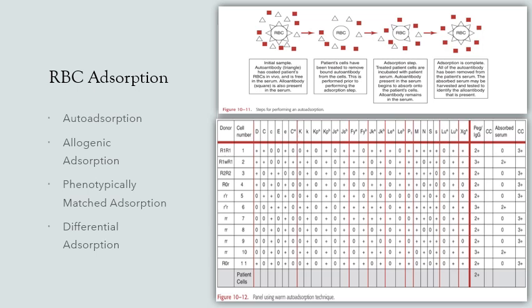So there is another example in resolving antibody identification. It is the alteration in pH because most antibodies react best in neutral pH, which is 6.8 to 7.2, but some react at 6.5. So like anti-M, which reacts at 6.5 pH. So acidifying the test system will help identify anti-M.